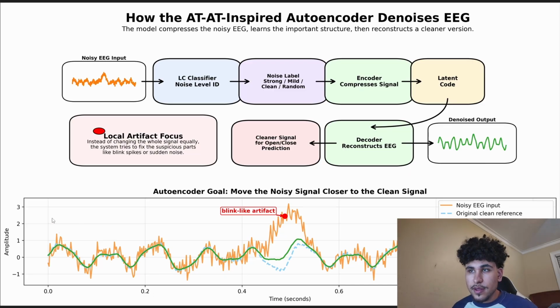And then this is just a quick graphic to show what it looks like in real time. The orange line shows a noisy or corrupted EEG signal, then the blue dashed line shows the clean reference point. Then lastly, the green line shows the autoencoder's reconstruction of the noisy signal. So as you can see, there's all this noisy data, then the autoencoder reconstructs it similar to the original pattern.